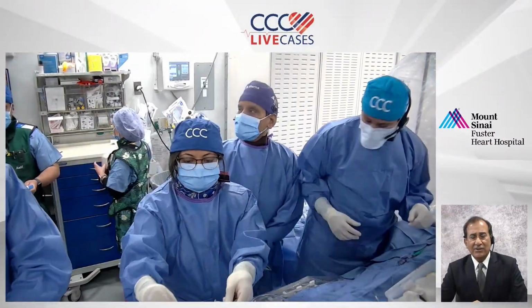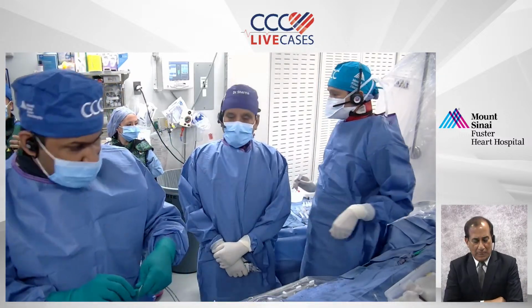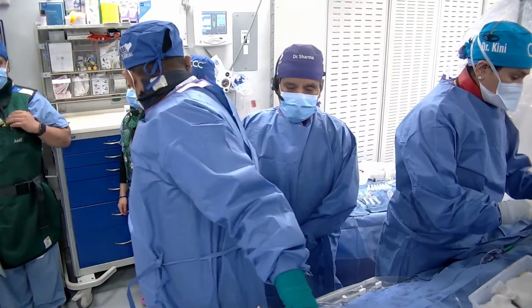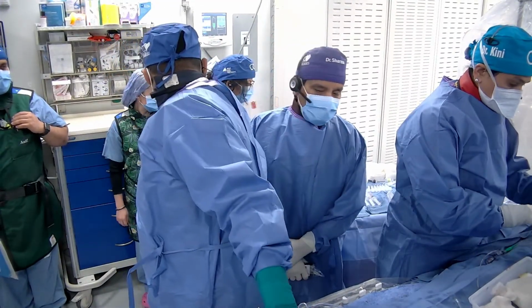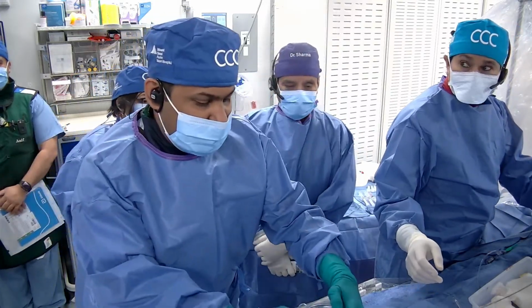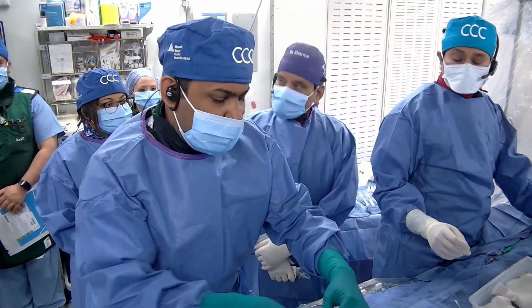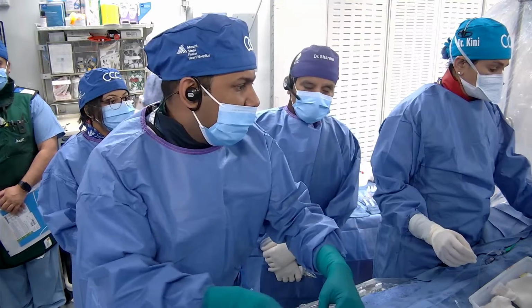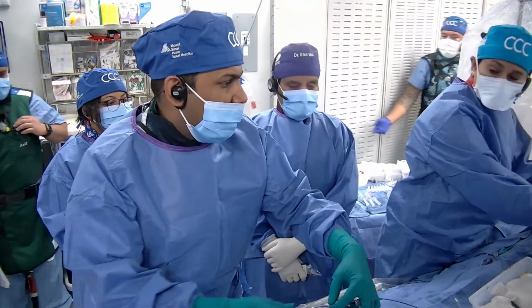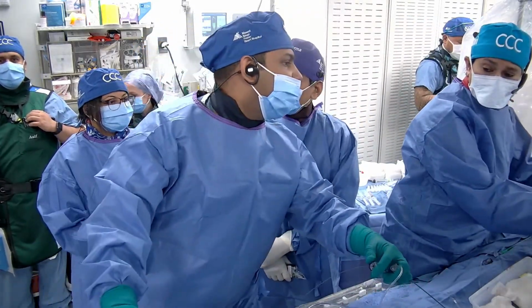Sameen, good morning. Is that your recollection also that it is the CTO which brings the biggest audience? Yeah, so clearly, welcome to our CCC live viewers globally. Myself and Dr. Kini on my left side, and we are two fellows, Swati and Pratish. We have the biggest fellowship in the country. What you said is the retrograde. So I would say that there is a lot of interest on the retrograde CTO PCIs. We have done probably 4 or 5 cases over the years. So we have one of the largest audiences on that when we do the retrograde cases, because we go through the step by step.